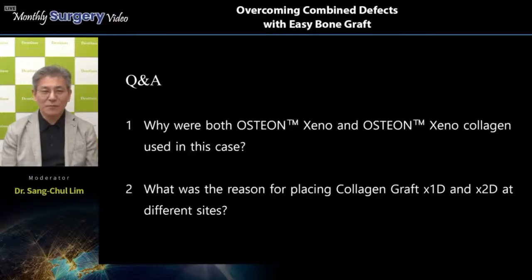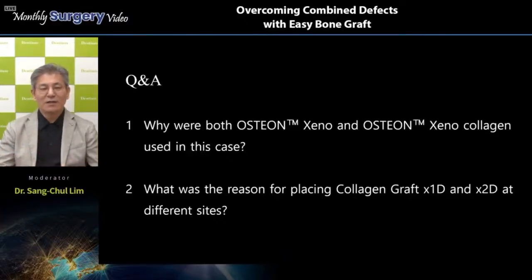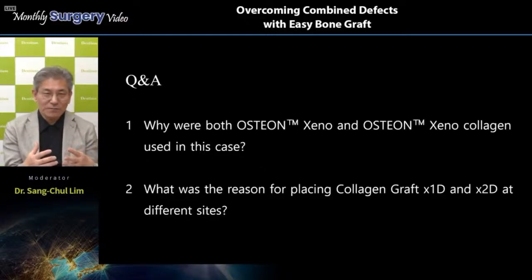Actually, generally speaking, the particulated bone is better than the collagenated bone in volume stability and new bone formation. Why? Because the collagenated bone has some collagen material as a binder. So this collagen should be absorbed and then new bone infiltrates between the bone particle areas, and finally newly forming bone is made. So the osteogeno collagen has a little bit of volume shrinkage compared to the particulated bone. So the particulated bone is more stable and a better situation for new bone formation, right?